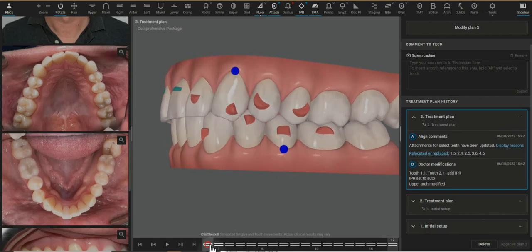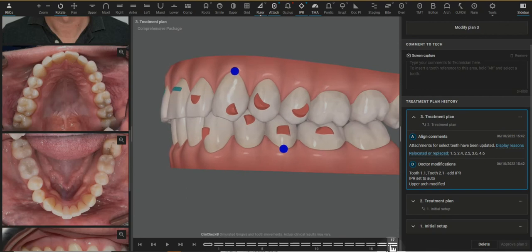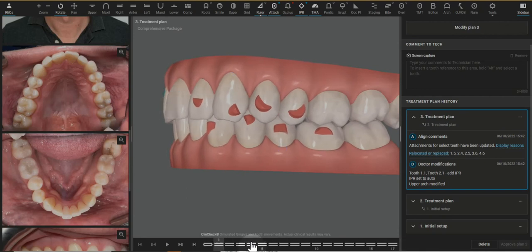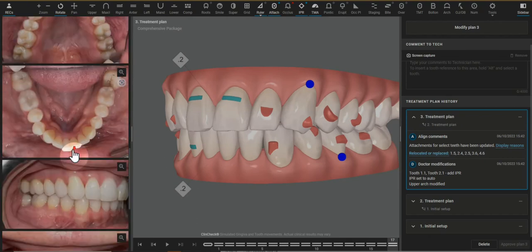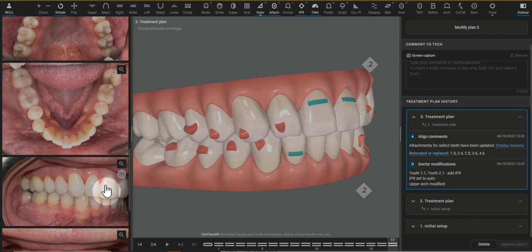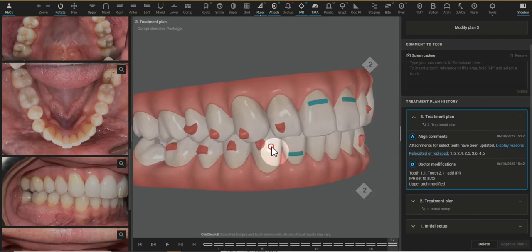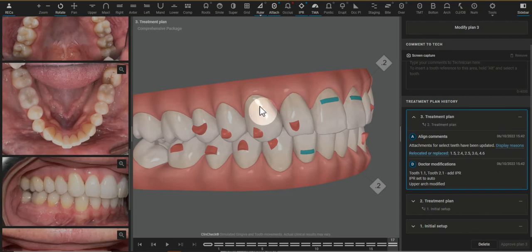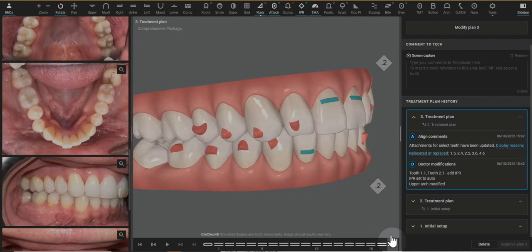And then the canines — this type of mesiodistal root torque movement is not what we want to see. The goal of the case is to improve the smile. We can already see a little bit of a black triangle that he is starting with here. So tipping the crown of this canine mesial and trying to push the root distal is really difficult movement.